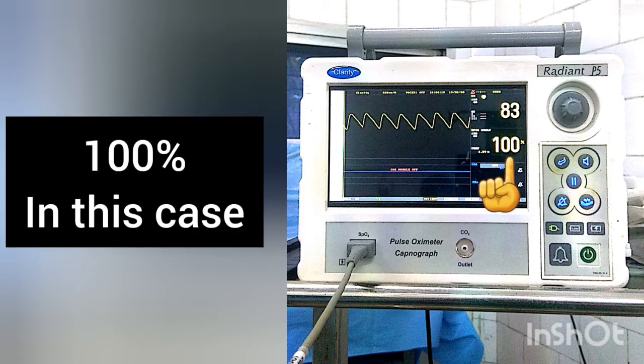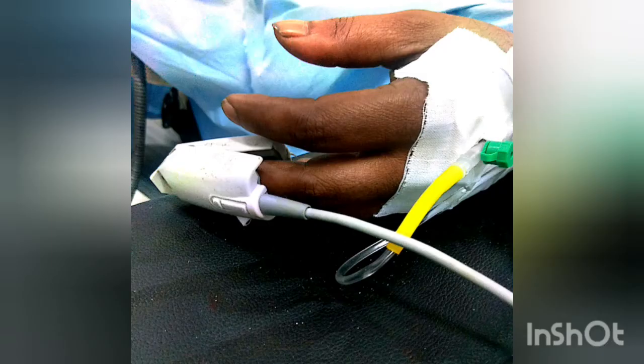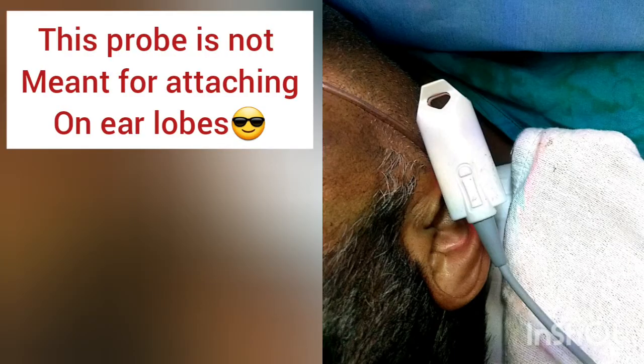Pulse oximetry is a very common, simple, and non-invasive monitoring technique. The probe is applied on fingertips or toes or ear lobule or even tip of the nose. In case of an infant, it is applied across the foot.